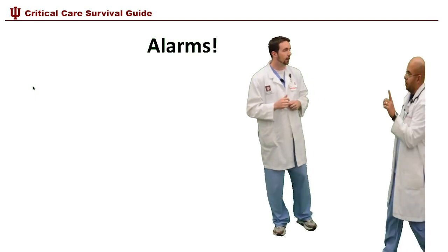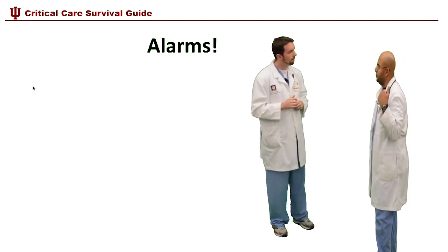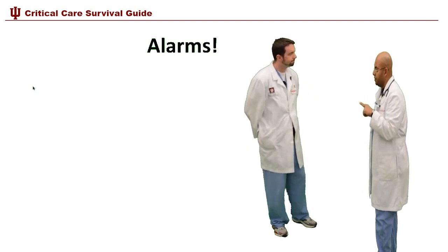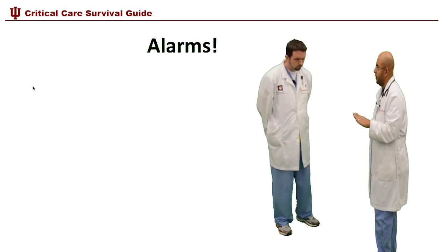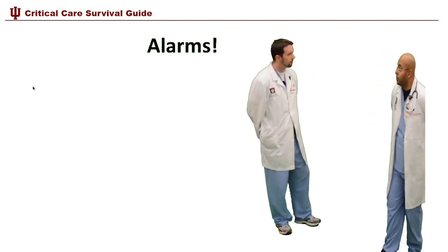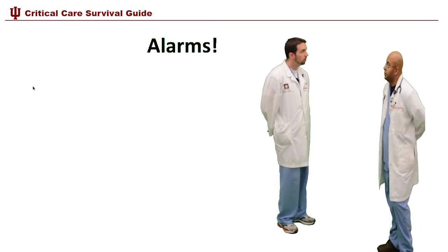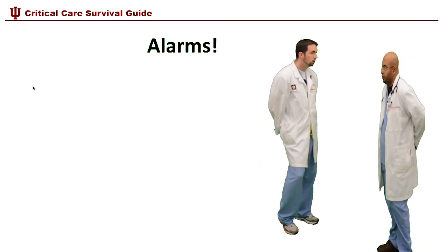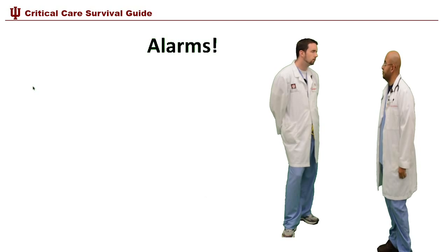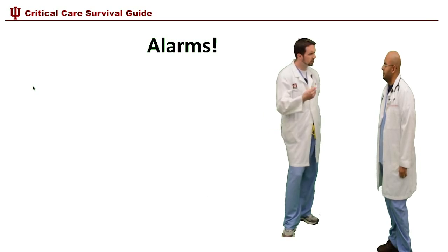Dr. Grant. Yeah, what's up? Patient in 2130? Smith? Yeah, what's going on? The vent keeps alarming and I don't know what's going on. Well, did you examine the patient? Yes, I did. Anything wrong? Nothing. Equal air entry laterally. What's the plateau pressure? Is it okay? Fine. Less than 30? Yes. Did you pass the suction catheter? Yes, I did. Passed easily?